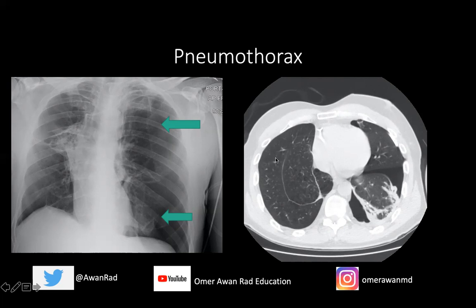Very easy to diagnose on CT as well. On the more normal right side, you can see the bronchovascular bundle. There is a little emphysema with some dark holes. But on the left side, we see lung parenchyma alongside really dark hyperlucent or hypodense air foci — a triangular area of dark air and a small focus at the apex. This is a pneumothorax, very easy to identify on CT and chest x-ray. No one should have any problem identifying a pneumothorax or a pleural effusion.